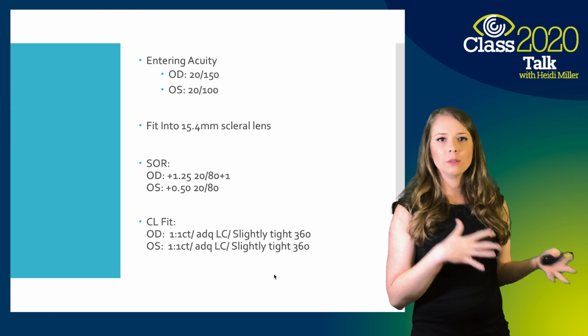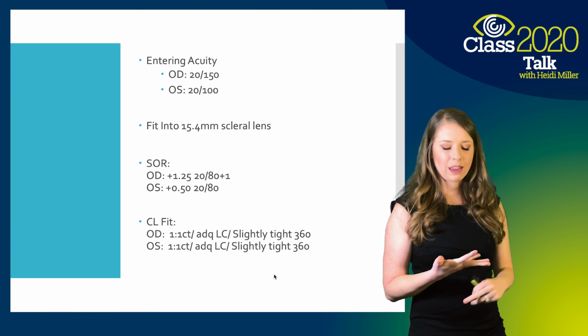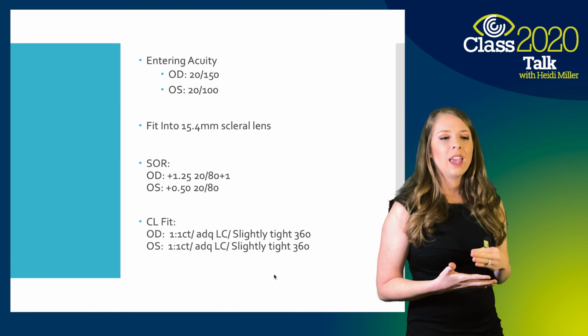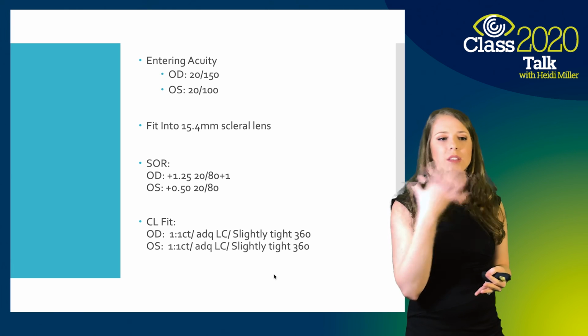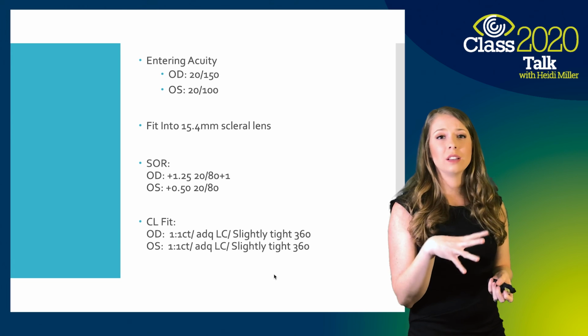We can always down the road go bigger and refit to larger lenses, but I want to make sure they were successful and they were getting the lens on the eye and that we were at least getting some therapeutic option versus nothing. And so when I did her over refraction, you could see even with the sclerals on, it was still 20/80. And that was just because of the degree of surface SPK irritation.